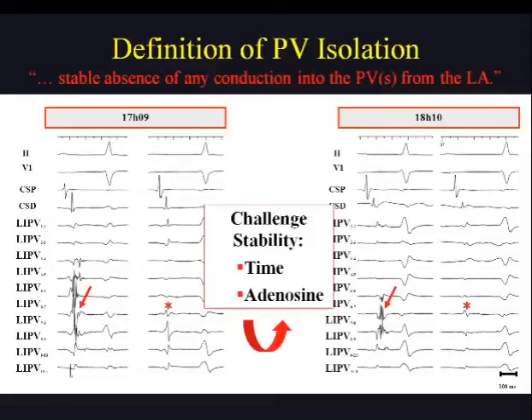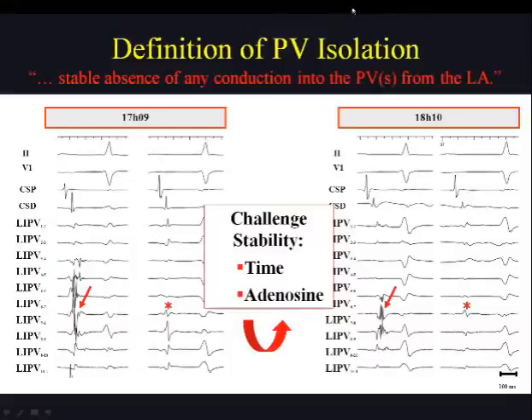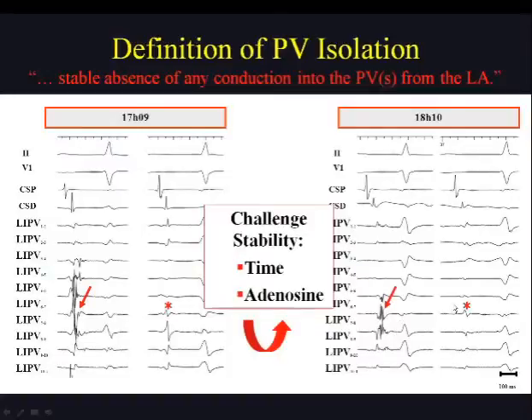Here is an example of the effect of waiting time at 5 o'clock in the afternoon. This left inferior pulmonary vein is isolated, as you can appreciate from the recordings of the circular mapping catheter, but one hour later, there is reappearance of sharp pulmonary vein potentials, indicating that additional ablation is required.